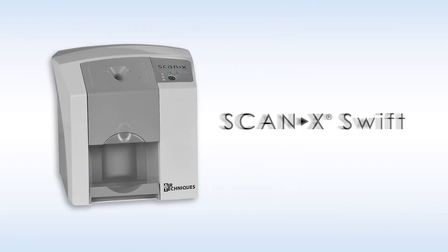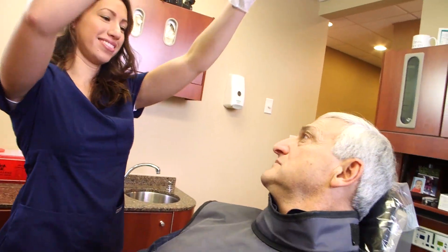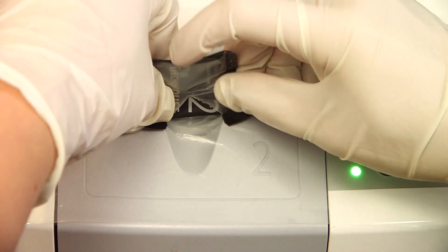But if you're looking for a chair-side system, go for the more compact ScanX Swift. It accepts intra-oral sizes 0, 1, and 2, and images are ready in 9 seconds or less. If you already own wired sensors, ScanX Swift would be the perfect addition to your practice, serving as a backup for patients with smaller mouths or TMJ issues.